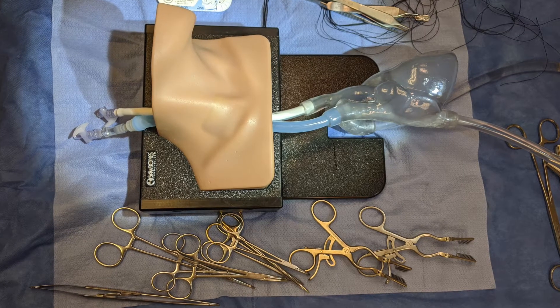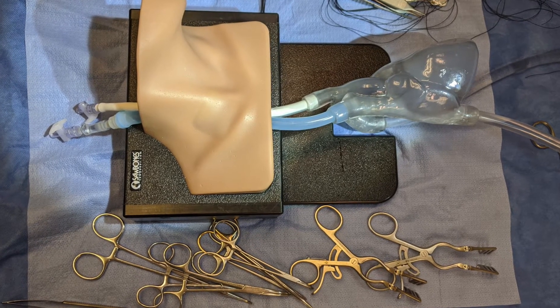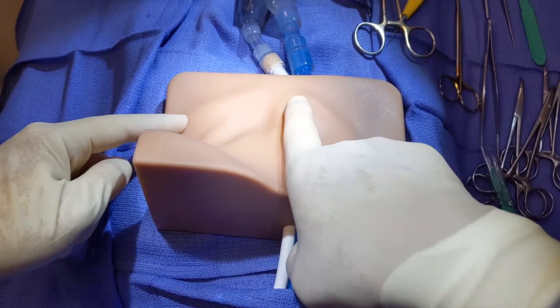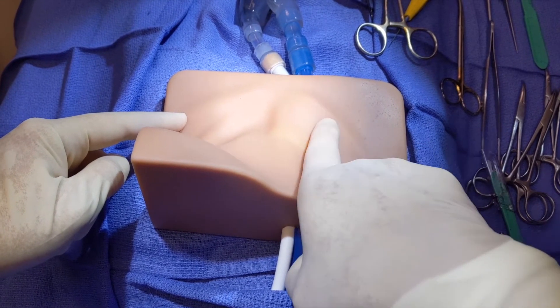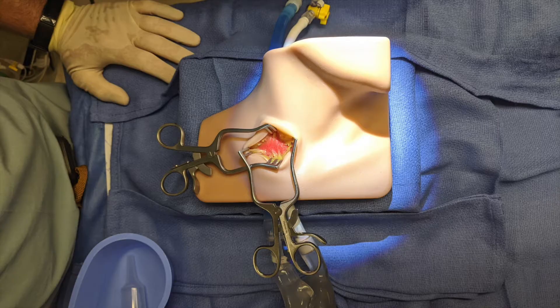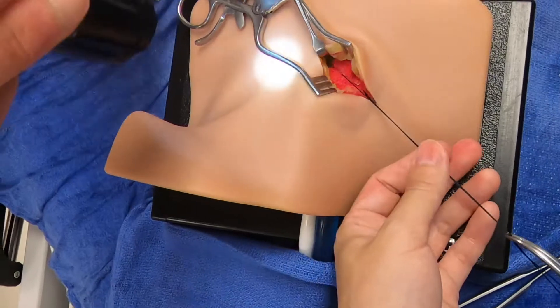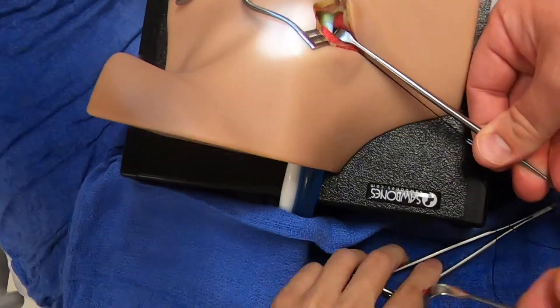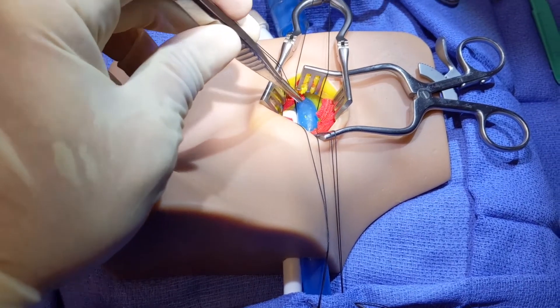We created a two-component trainer to include the neck and the heart. The neck is for single use and exhibits anatomically accurate external landmarks such as the mandible, clavicle, and sternocleidomastoid muscle underneath the skin. During dissection, the platysma, sternocleidomastoid muscle, internal jugular vein, carotid artery, and vagus nerve are readily identified.